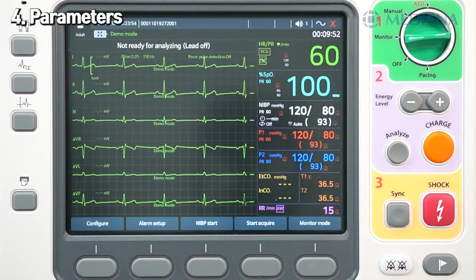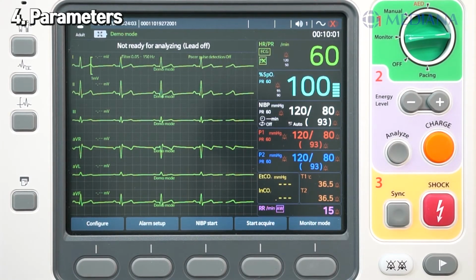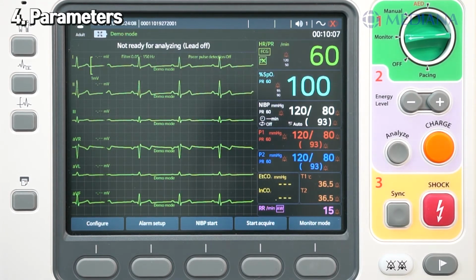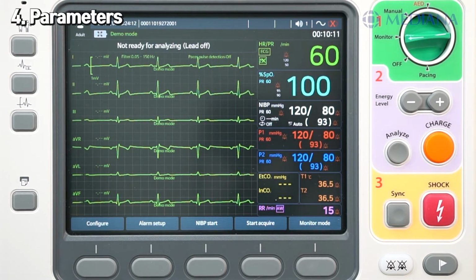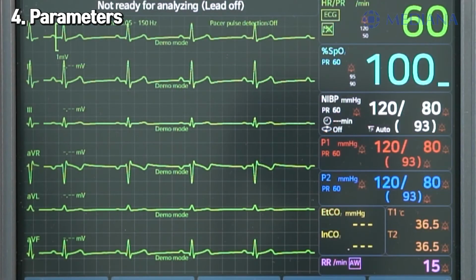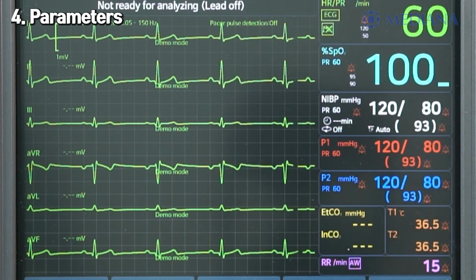A brief explanation regarding the algorithm we use for ECG is that it's considered to be the best in class by cardiologists. It was developed at the University of Glasgow in the UK, and includes signal processing, diagnostic interpretation of electrocardiograms from individuals of all ages, and analysis of cardiac rhythm. It also has leading clinical advantages and proven performance for STEMI analysis.